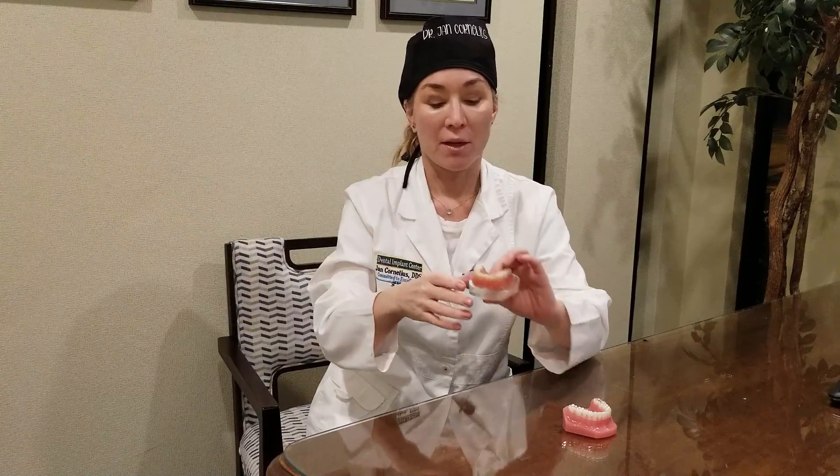When you speak, you can count to ten with no lisping or forcing of your tongue. We try them in — if the teeth are supporting your lip, parallel with your pupillary line, right along the midline with perfect symmetry, then we go on and set the rest of the teeth. You try them in, and if you love them, we'll go to finish.